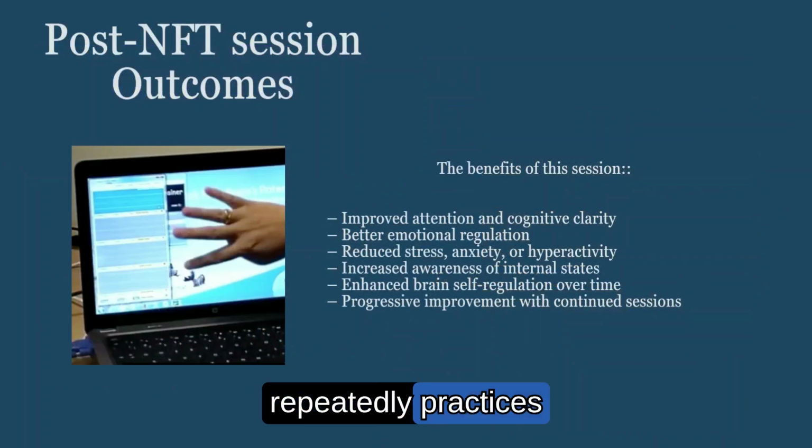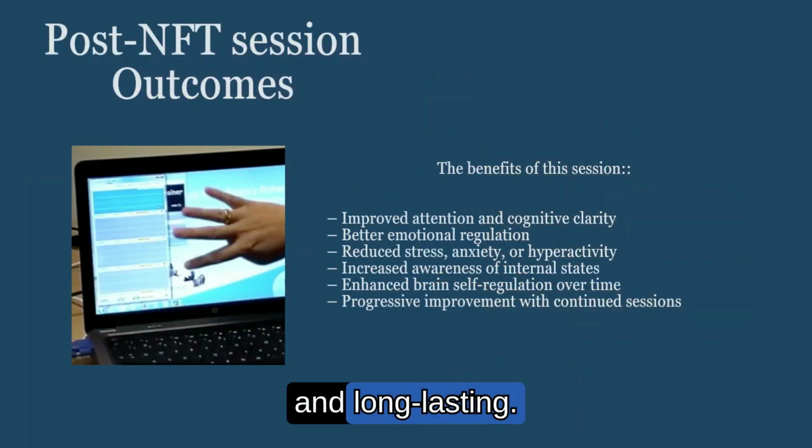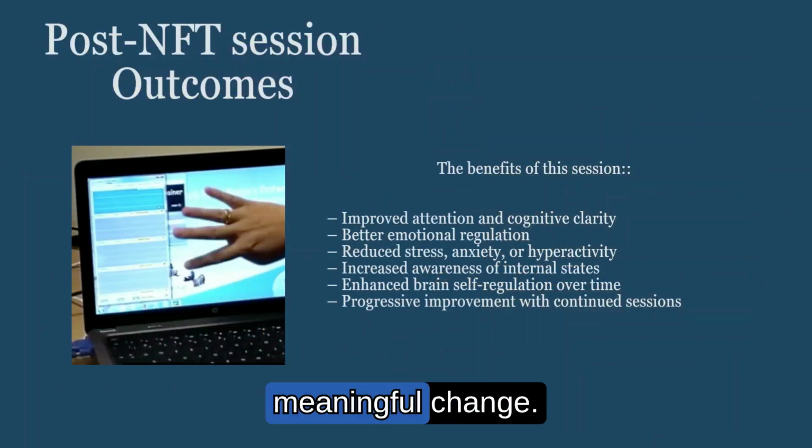Over time, as the brain repeatedly practices healthier patterns, these improvements become more stable and long-lasting. As with any training, consistency is key. Neurofeedback effects build over multiple sessions, creating gradual but meaningful change.